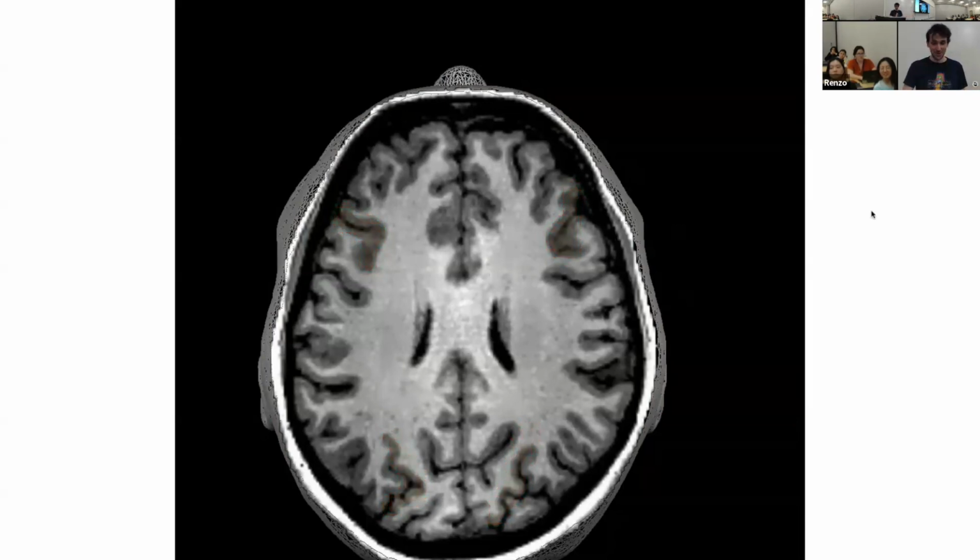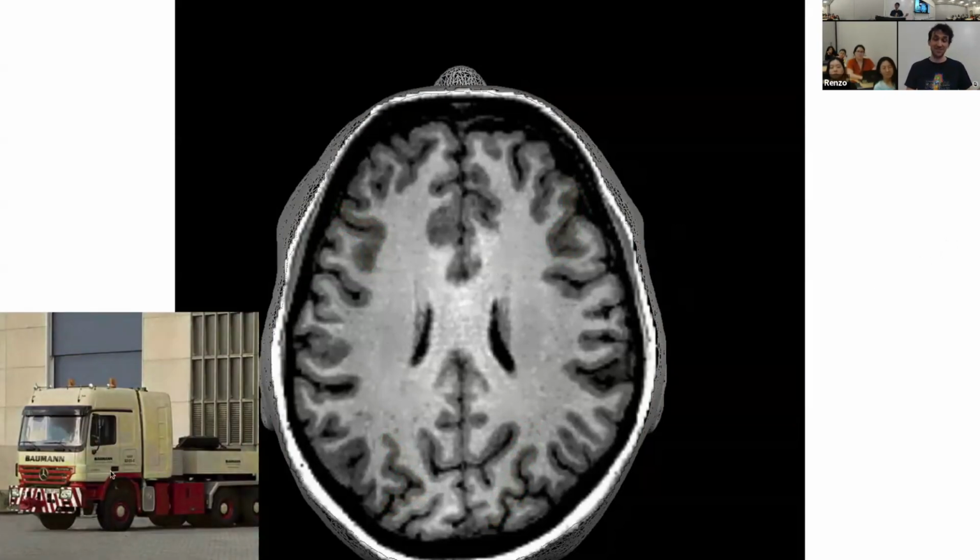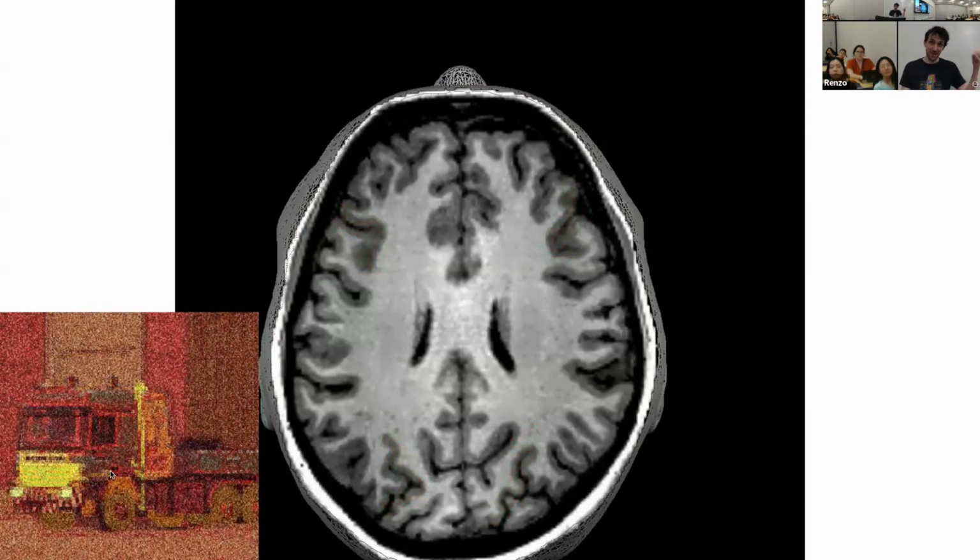And some of you know this metaphor, but some people say that trying to understand how the brain works by looking at these blobs is somewhat like trying to understand how a truck engine works by looking at it with an infrared camera. You see which brain areas are consuming energy, like when the truck is driving, the front is heating up, which is cool, but it doesn't really tell you how the truck engine works, right? We need a different spatial scale of the densely packed microcircuitry to get a better mechanistic understanding of the brain, which is why we need high resolution.